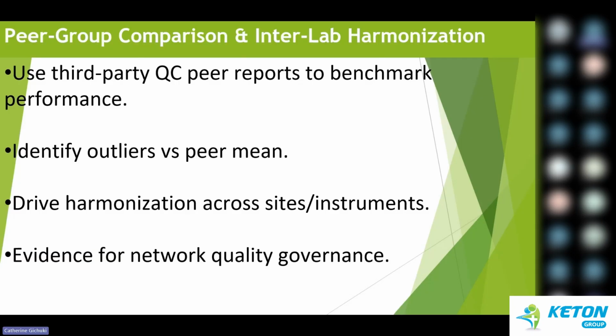So then you make results consistent across sites. Comparison aligns performance between branches and different instruments, like I have mentioned. So patients get comparable results everywhere. So that is what we achieve by using third-party QCs.